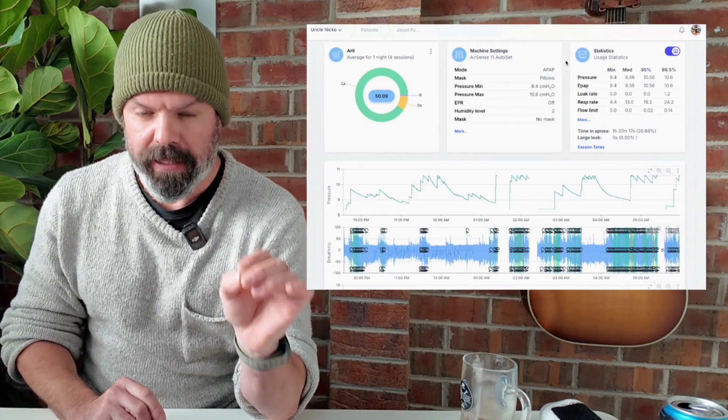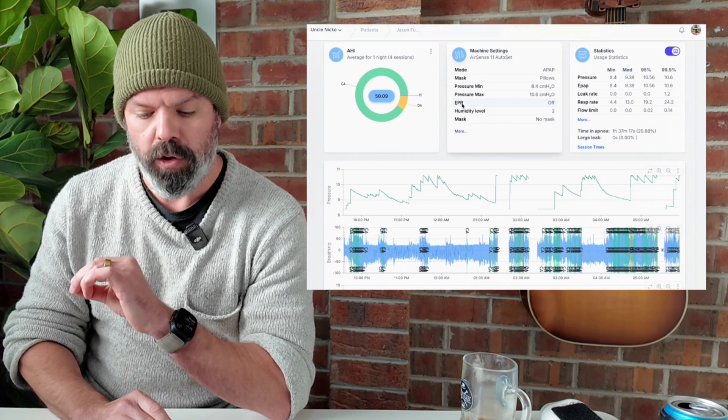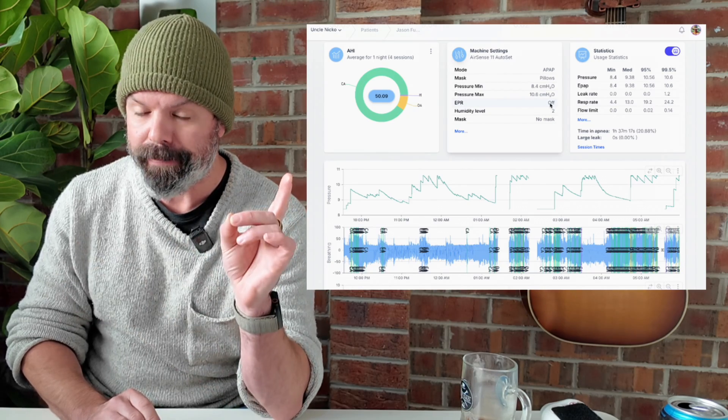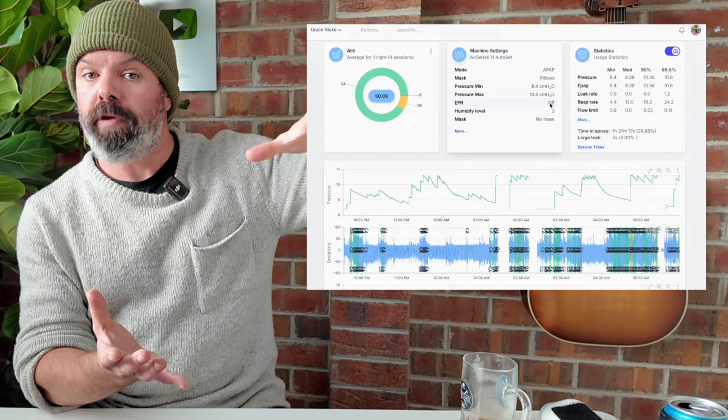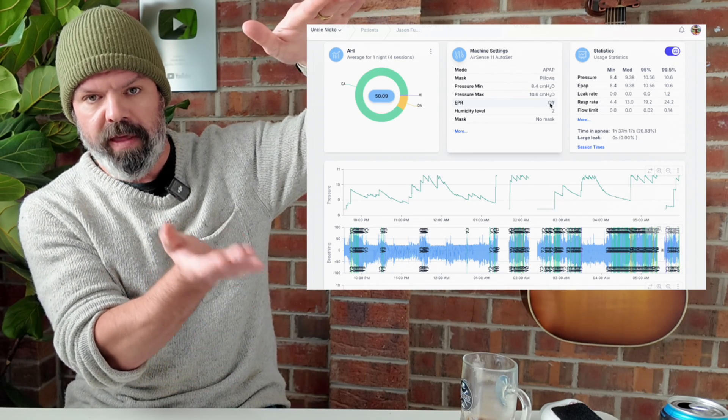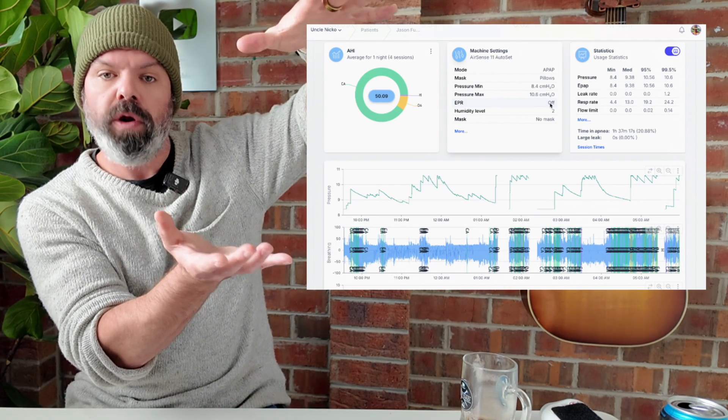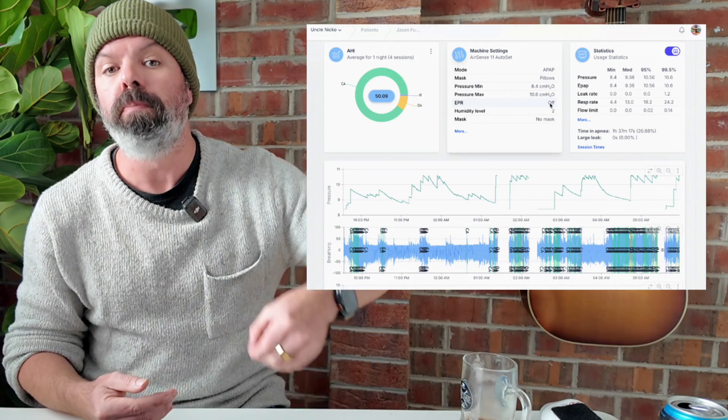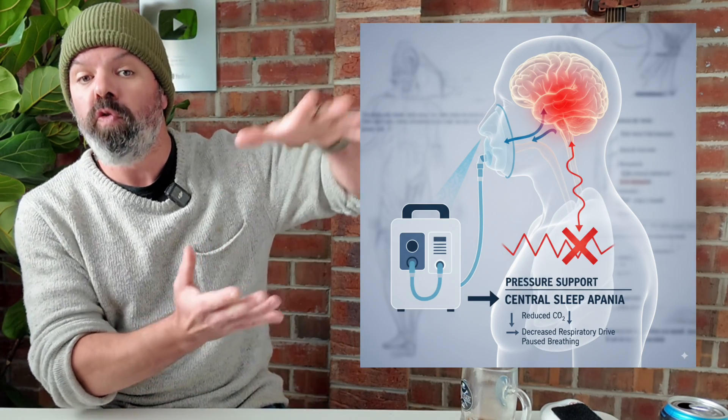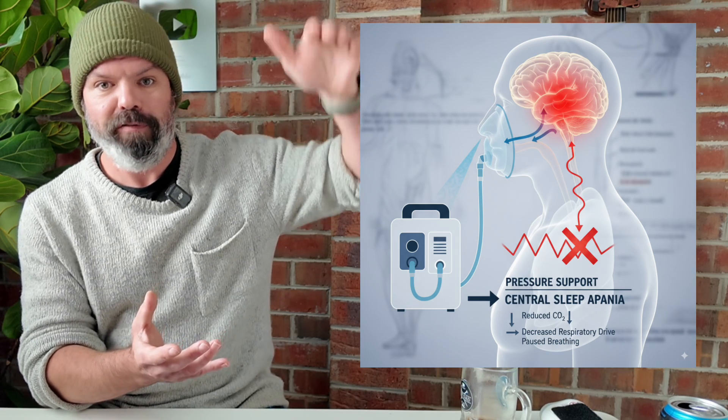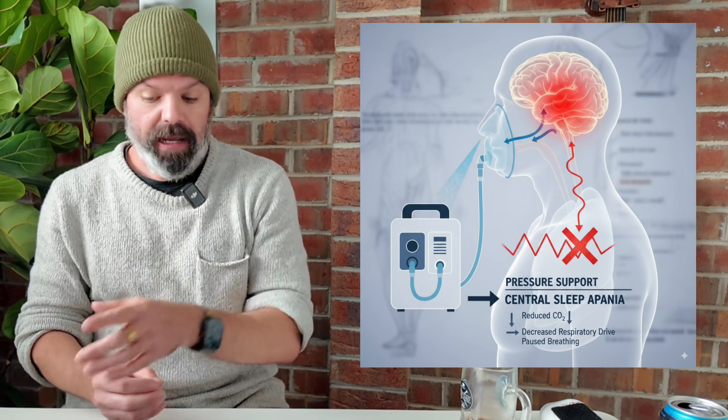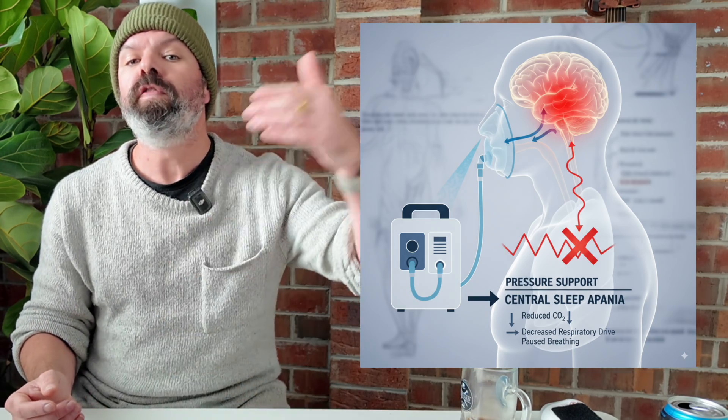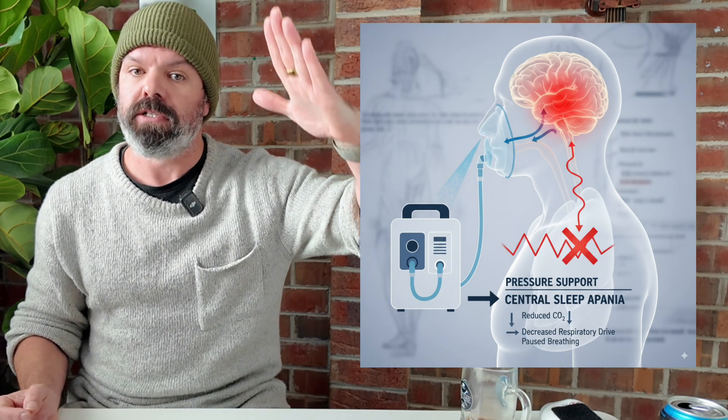Now something else that's really important is this. EPR, expiratory pressure relief, which is currently off, and that is a good thing. When you increase EPR, that is the difference between the pressure when you breathe in versus the pressure when you breathe out. When you create that gradient, we call it pressure support. What it does is it helps to ventilate patients, which is removing carbon dioxide. If we go from pressure support of two to three, we're going to be removing more carbon dioxide. If we go to three to four with a bi-level, four to five, once again, we're removing carbon dioxide. And as I've just shown you, if things get out of balance, we remove the CO2, we're blowing off CO2 because of this pressure support, the pH is going to rise.